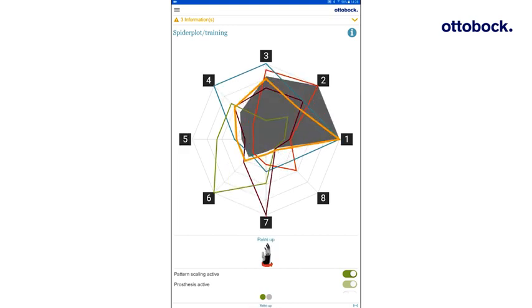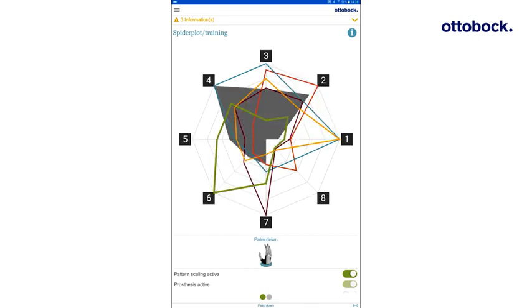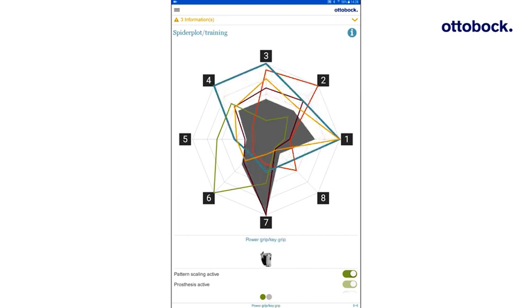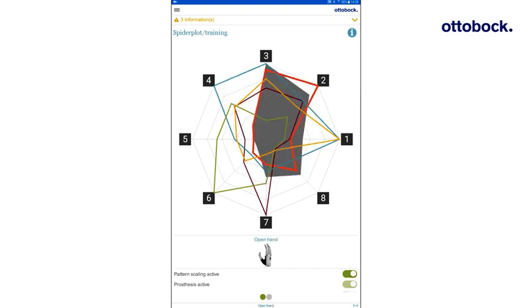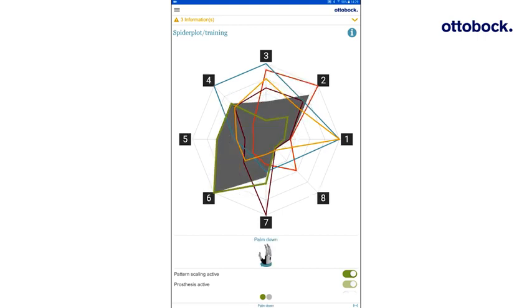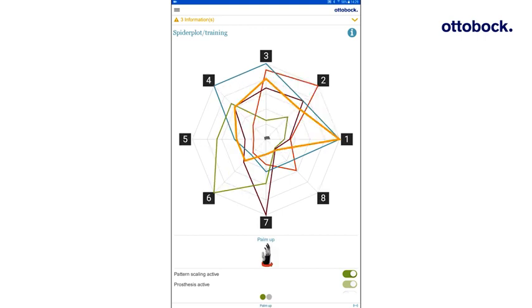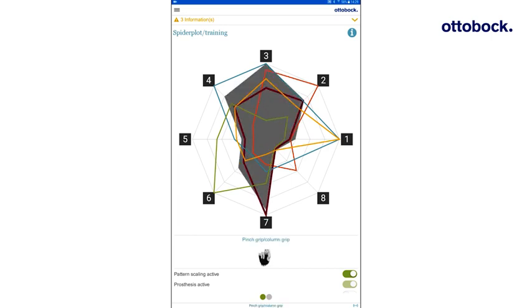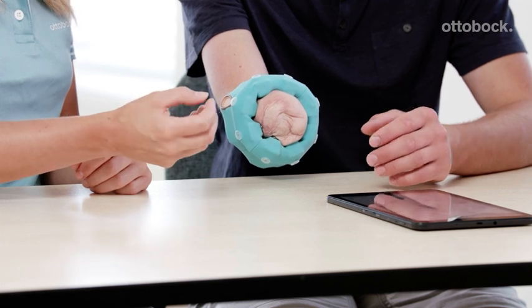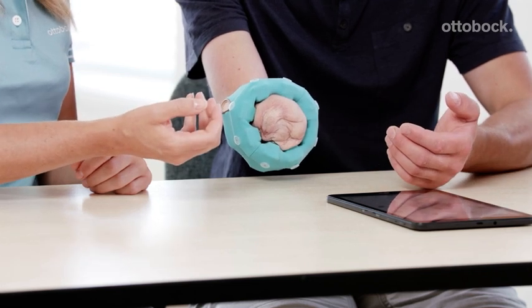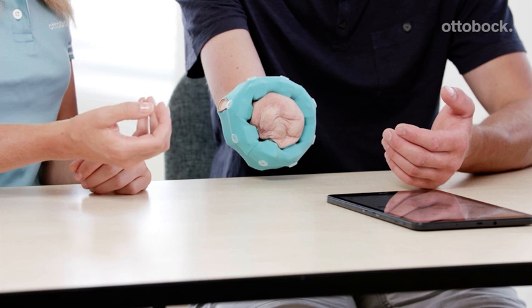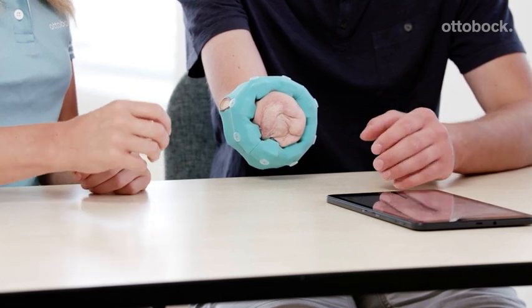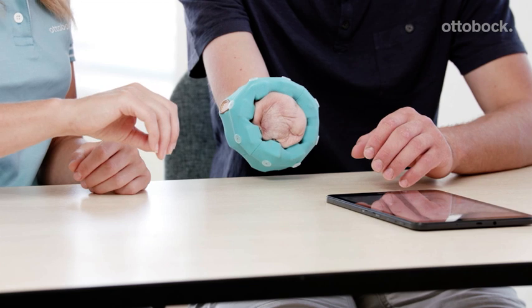Now test with the Spider Plot or the movement display if MyoPlus can separate all movements. If the control is reliable, the phantom hand movements can be used for the interims or definitive prosthesis. If the control is not reliable, try to find alternative phantom hand movements. The evaluation with the MyoCuff should give a good indication on how many patterns a user can produce. If the user can benefit of the MyoPlus control, the next step is to create an interims or definitive prosthesis.